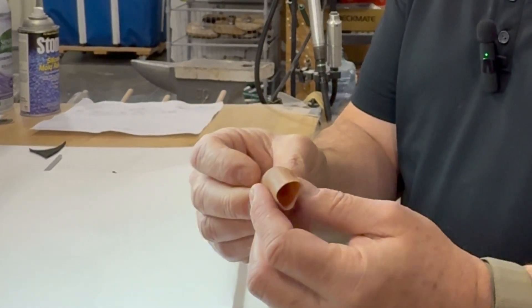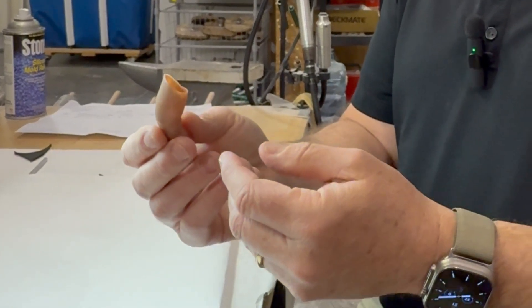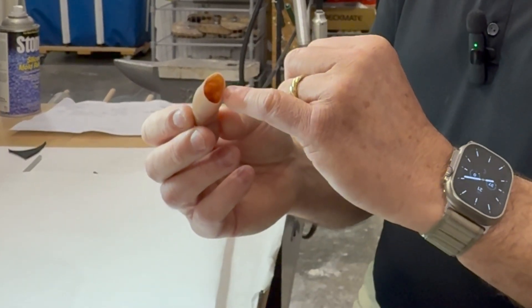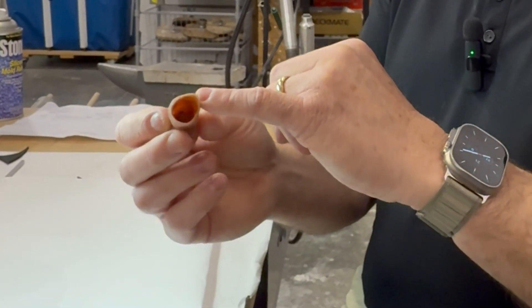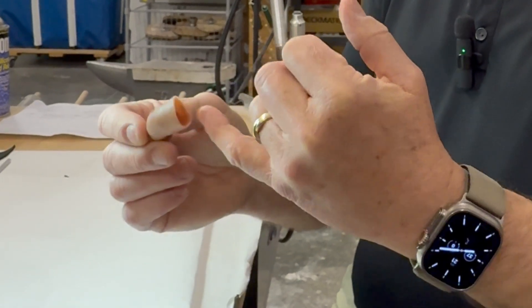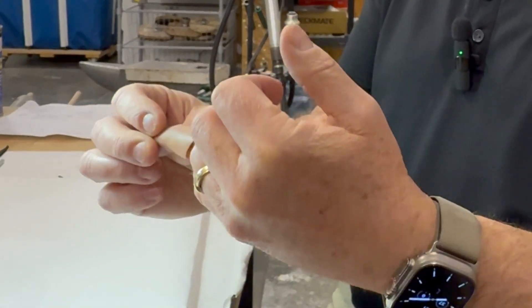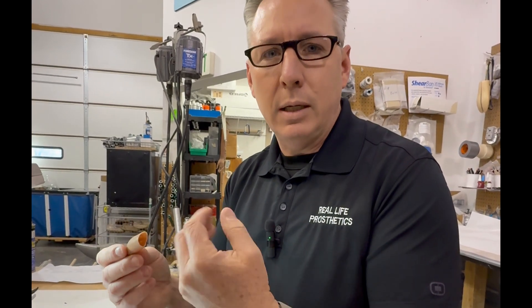I take the prosthesis back into the lab and take a close look at it to make sure there's no separation of silicone — the layers between the external layer, which is like a clear skin, and the underlying skin tones, which is a different type of silicone. Sometimes we do get separation, so I'll have to get in there and re-bond the surfaces together.